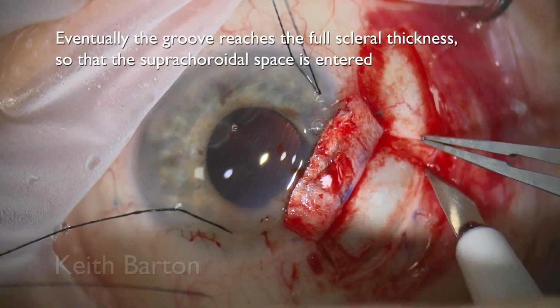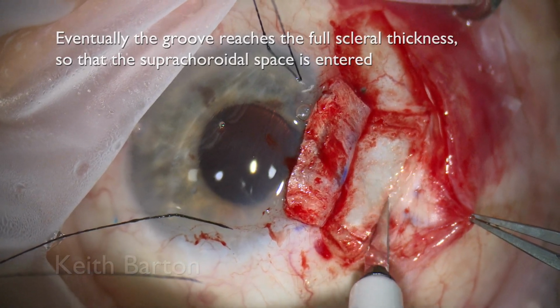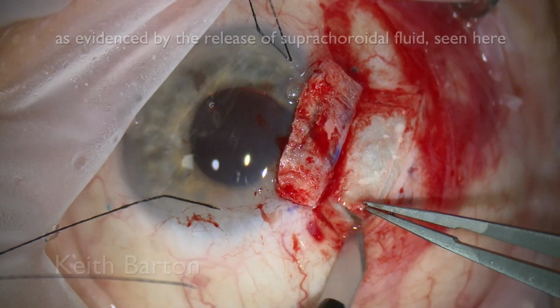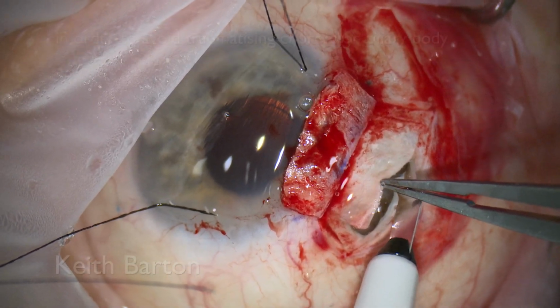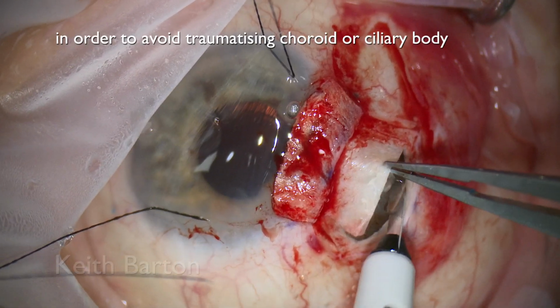Eventually, the groove reaches the full scleral thickness so that the suprachoroidal space is entered, as evidenced by the release of suprachoroidal fluid seen here. The remainder of the flap is opened fully with the blade reversed, cutting upwards, in order to avoid traumatizing choroid or ciliary body.